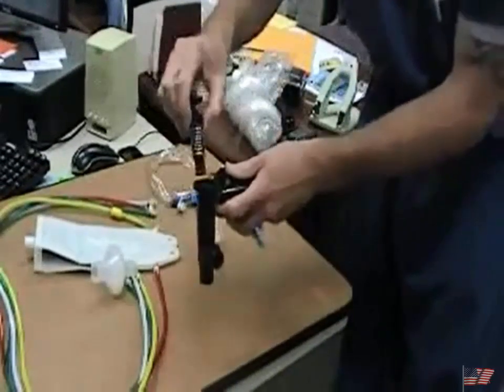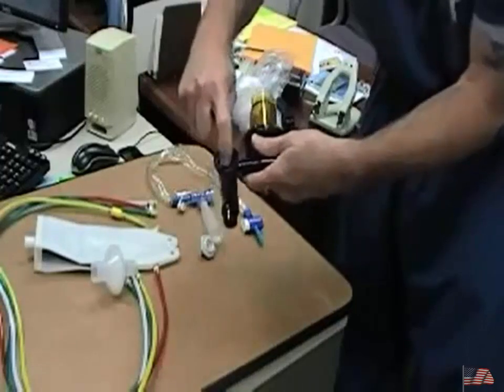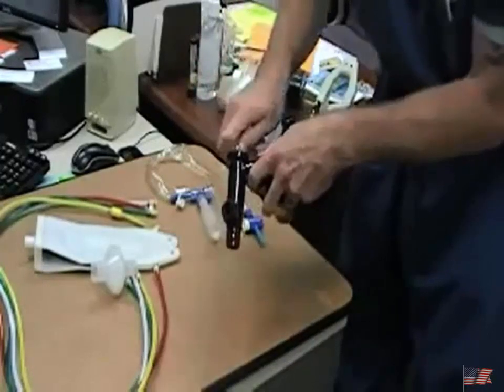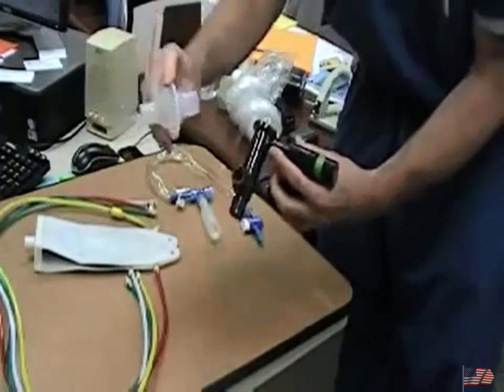Alright, spring for the phasotron goes in here, and see when we apply pressure to it, that's going to bounce up and down and give you the Venturi effect. Okay, here's the cap of the phasotron. Now extra accessories, just a regular bacteria filter.